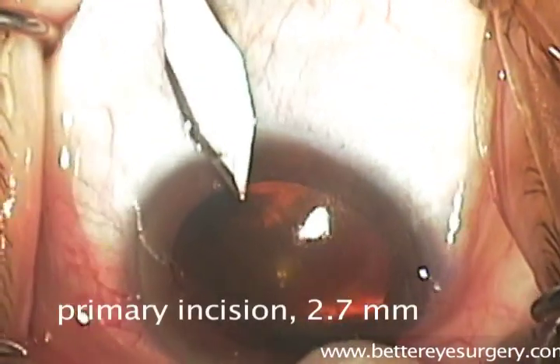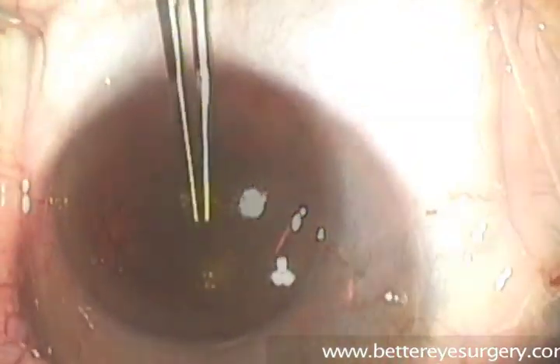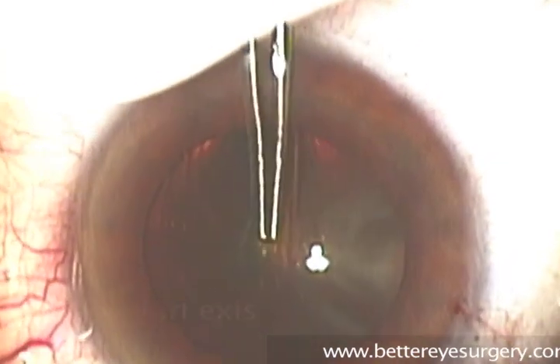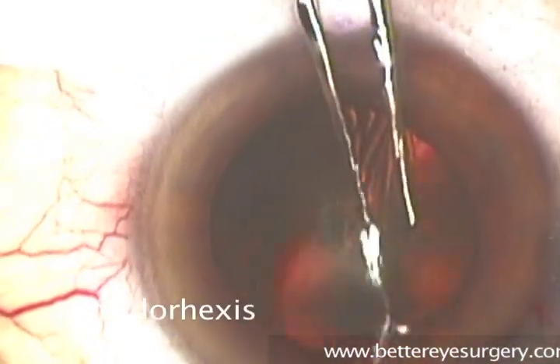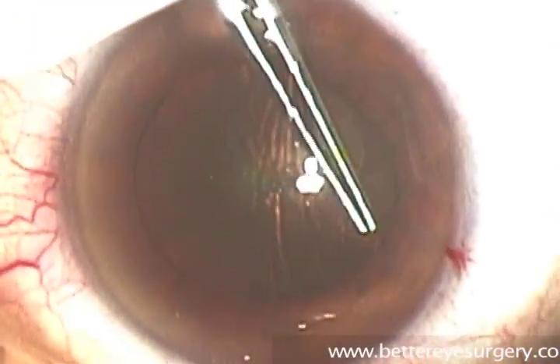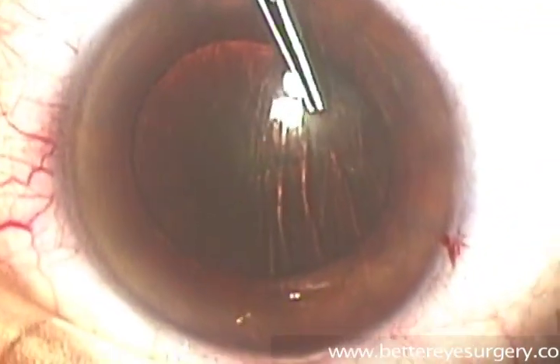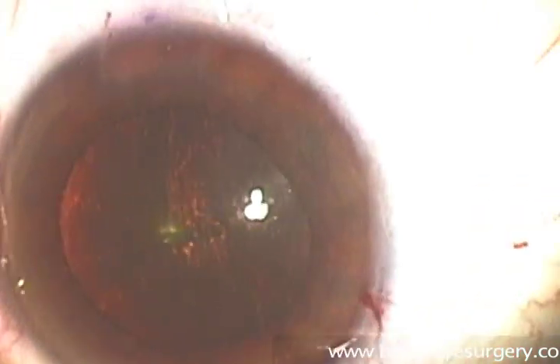Next, a second larger incision, about 2.7 mm in size, is made, and through this incision most of the work of cataract surgery will be accomplished, including capsulorhexis — a step where a fine pair of forceps is used to tear a circular opening in the front of the lens capsule. This circular opening must be continuous to maintain the strength of the edge of the capsule that is torn, and this allows the surgeon to remove the lens from within the capsule.